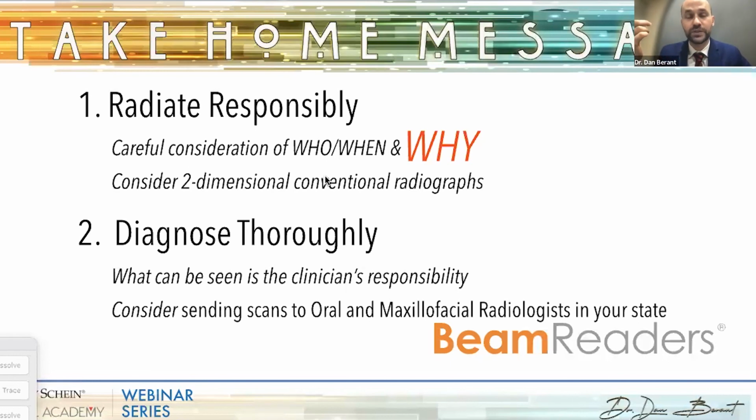When we approached the situation, I felt that it made more sense to do the root canal inside the mouth. The reason we did the root canal was because the parent of the patient, who was a young girl, was not very responsive and in the beginning not reliable. There were a lot of missed appointments, a lot of last second cancellations. And in the adolescent population, if resorption begins, it can occur very quickly.